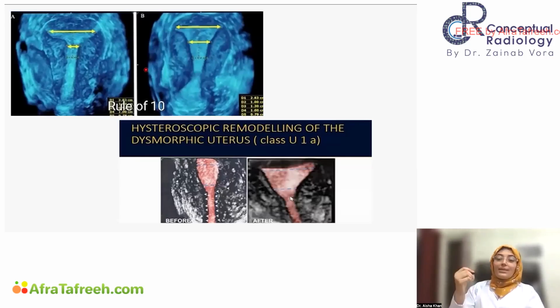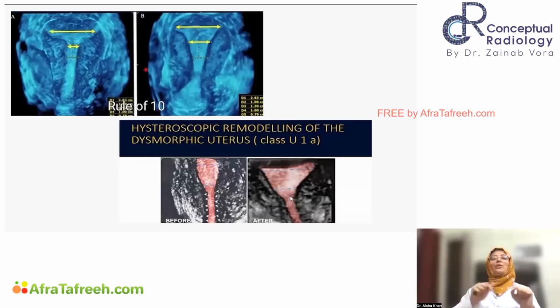Lower down image में हमें देखते हैं कि there is hysteroscopic remodeling because जो T-shaped uterus है, it can have a poor pregnancy outcome. So we just have to go, थोड़ा सा margin of safety लेते हैं and we resect that extra uterine wall very safely, keeping margin of safety, and then we can transform that cavity from a T shape to a normal triangular shape which can house the fetus.